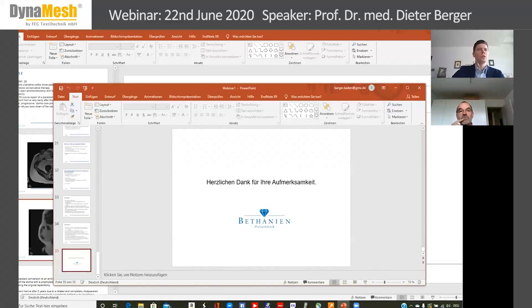Okay, thank you. One more question from Juan Ruiz Lopez. What about extra prosthetic material when you use the sandwich technique versus the Sugarbaker or the 3D funnel? What does it mean, extra prosthetic material? A double mesh. Another mesh. Yeah. A cheaper mesh for the keyhole and the expensive mesh for Sugarbaker. That may be possible, of course.